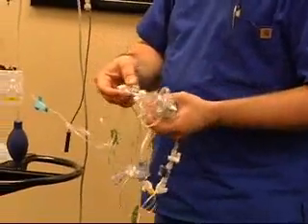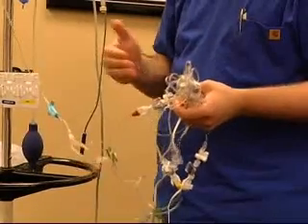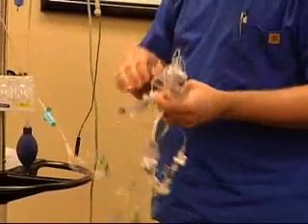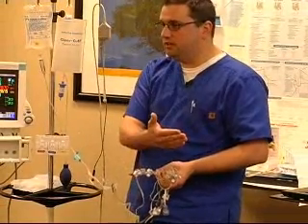Okay, progressive priming, these are vented caps, and they're vented so that they can be primed and then left on to keep the cap sterile until you're done with the zeroing portion when you insert it, and then you can take them off and replace them with the yellow caps, which are the closed caps. So the progressive prime, what I mean by that is that the stopcocks are turned off to the distal end.